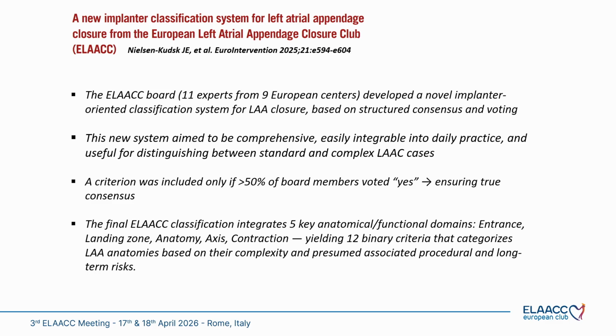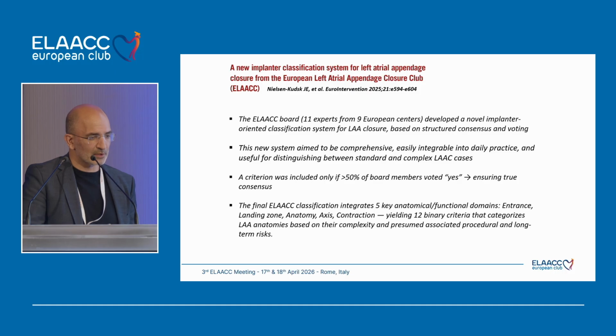And the final classification integrates 5 key anatomical and functional parameters. I will very quickly redefine those parameters. So the entrance, the landing zone, the anatomy, the axis, the contraction, yielding at the end 12 binary criteria, yes or no, that categorize LA anatomies.